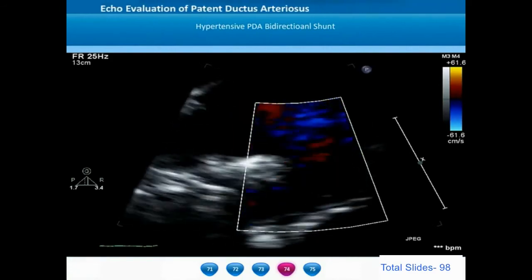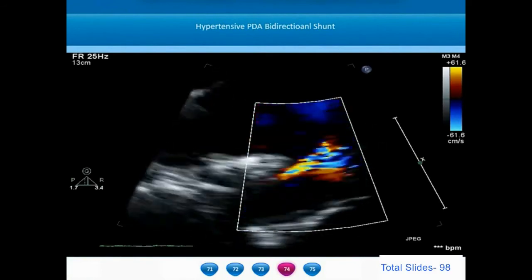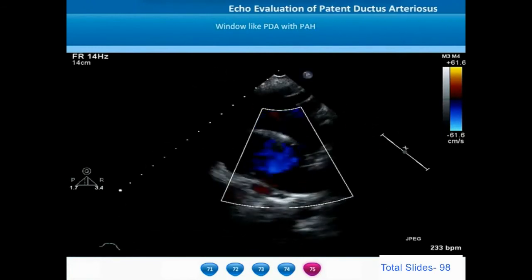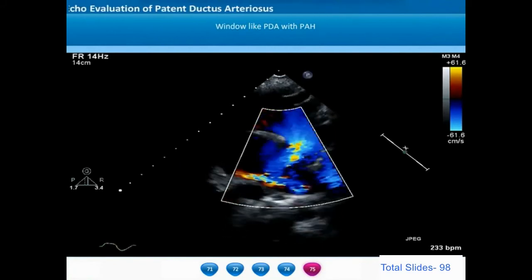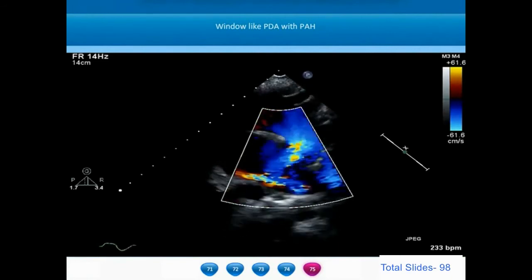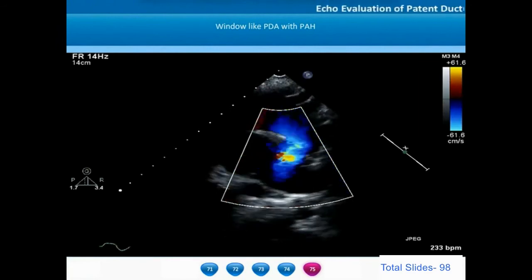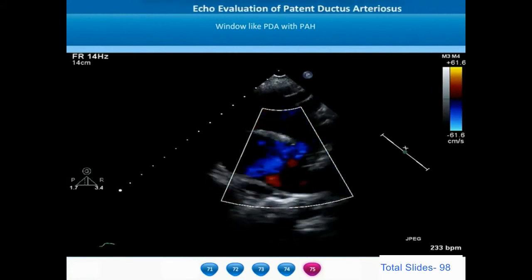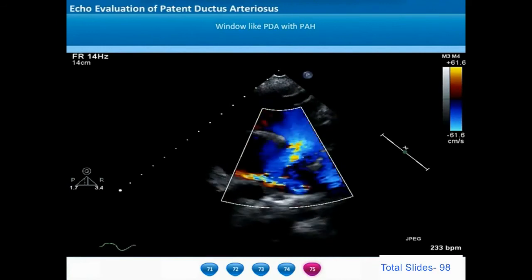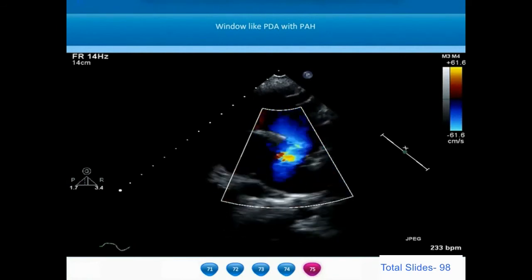When we magnify the ductal view, we can identify that there is no distance between the descending thoracic aorta and the pulmonary artery bifurcation — the ductus is more like an aortopulmonary window. From the suprasternal view, we notice the distal aortic arch and a large window-like ductus from the anterior wall of the proximal descending thoracic aorta communicating with the main pulmonary artery near its bifurcation. There is no length to the ampulla of this window-like ductus.